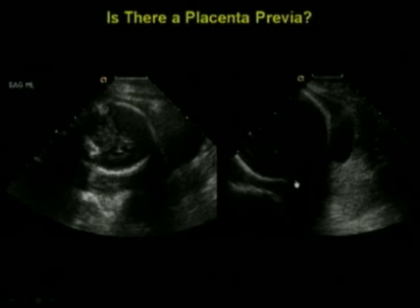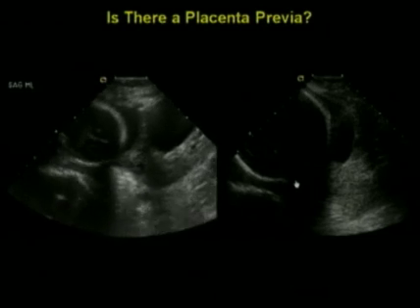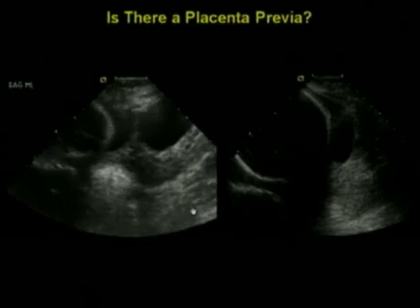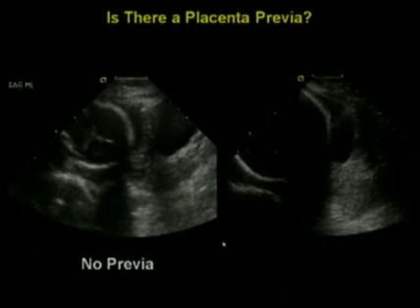So what we would do in these cases is try to push the baby's head up. And as you'll see in a minute, in both of these cases, I was scanning with my right hand. I used my left hand to try and lift the baby's head. And once the head was lifted out of the lower uterus, I could tell. So watch what happens on the image on the left when I push. Push, and the head goes up. And when the head is up and away, like right now, there's no placenta. So by pushing up, we get an answer to, is there a placenta previa? The answer is no, no previa.